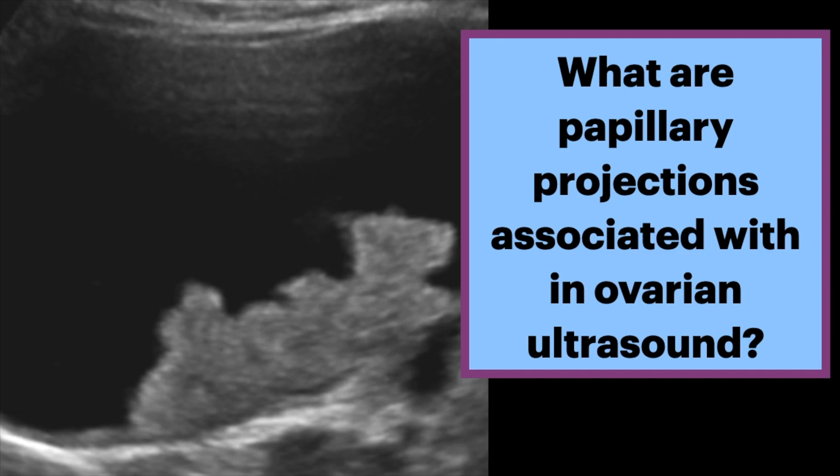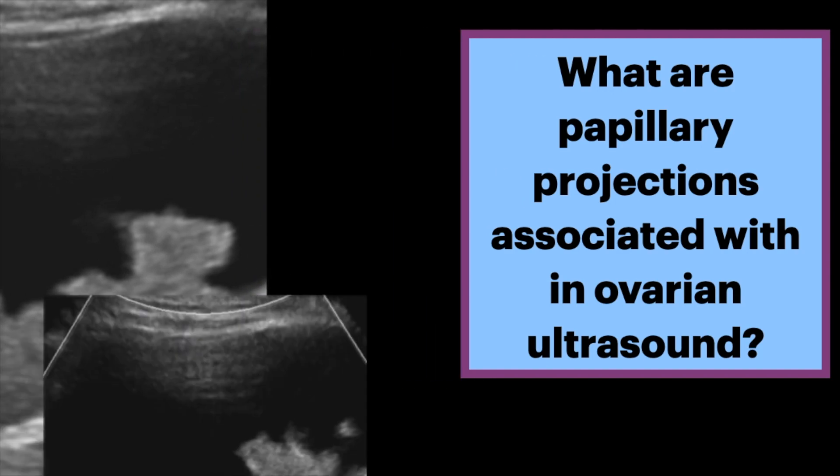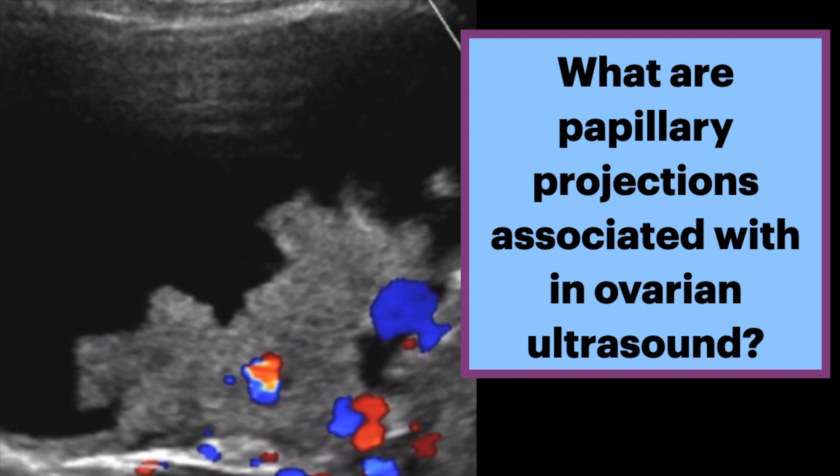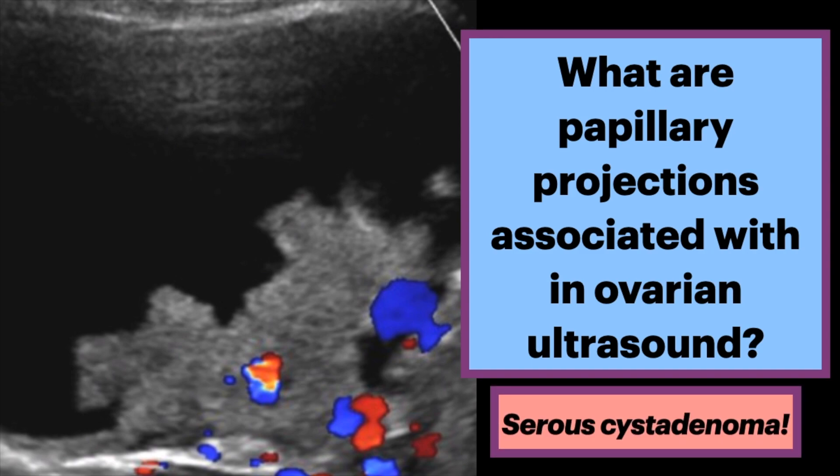What are papillary projections associated with in ovarian ultrasound? Here we see a cystic appearing structure with internal papillary frond-like projections. There is internal vascularity within these projections. The diagnosis is a serous cyst adenoma.